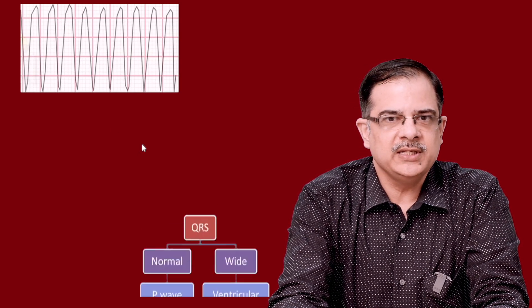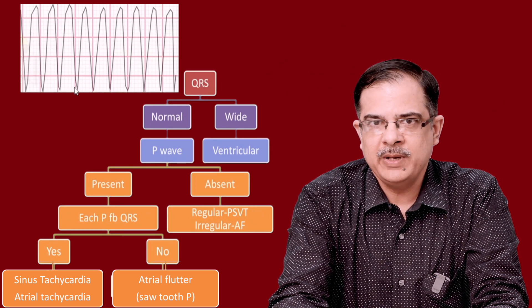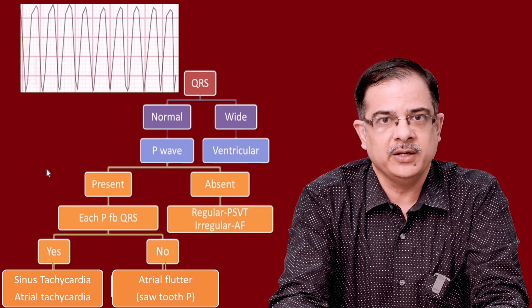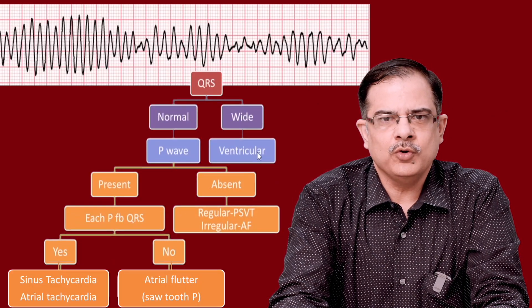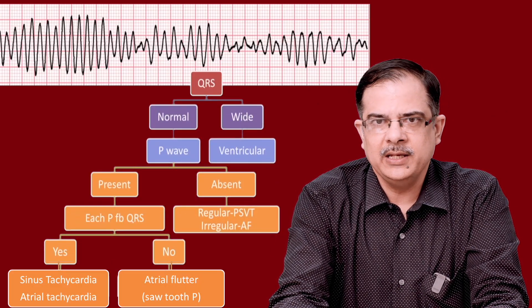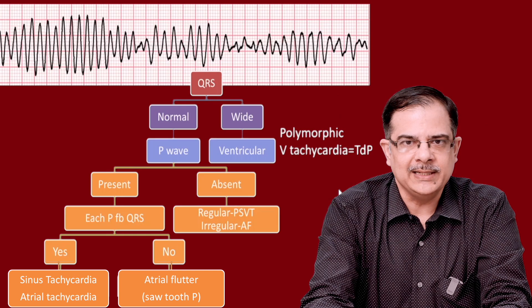Next ECG: these are wide QRS complexes — almost 5 mm. This is ventricular origin. The RR interval is 5 mm, giving a ventricular rate of 300, which is in the range of ventricular flutter. In the following ECG, the QRS complex morphologies are changing — showing an increasing then decreasing trend. This is a wide complex ventricular tachyarrhythmia with polymorphic morphology known as torsades de pointes.